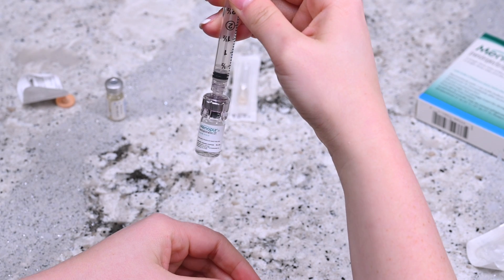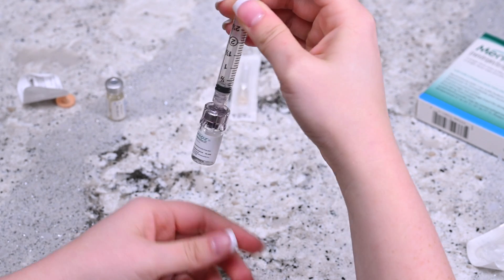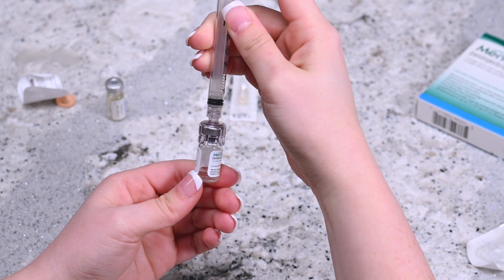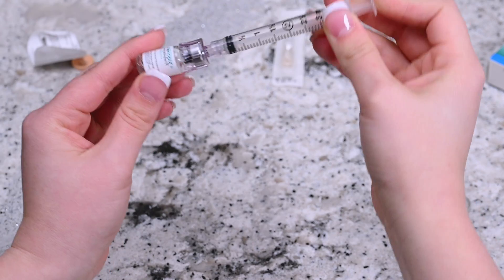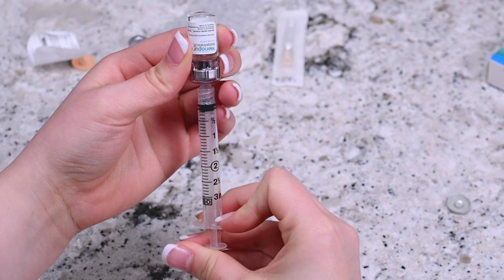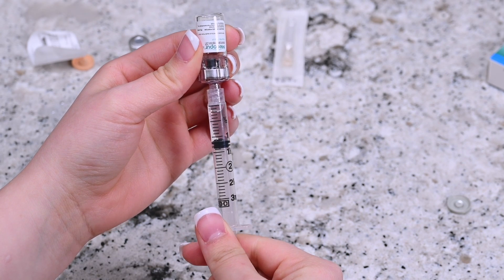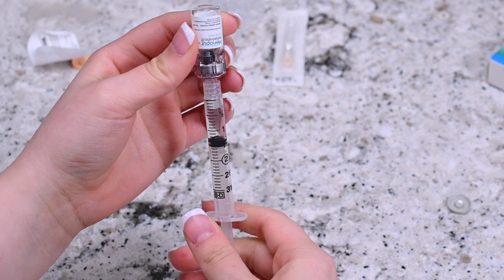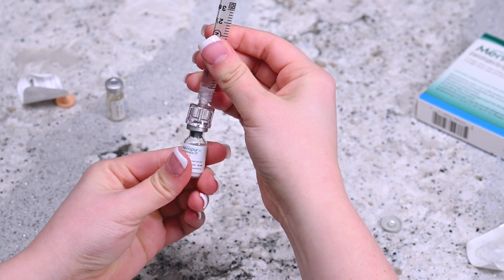After releasing all the liquid into the vial of Menopur powder, gently mix the contents until the powder dissolves. Do not shake the vial. Invert the syringe without removing it from the vial and pull the plunger back until all the contents from the vial transfer into the syringe. Remove the now empty vial from the q-cap by gently pulling the vial off the q-cap.